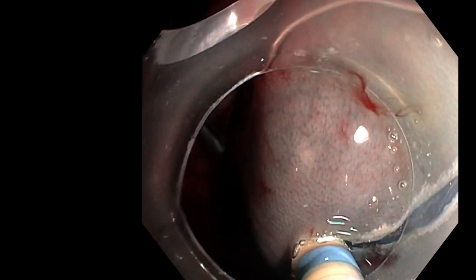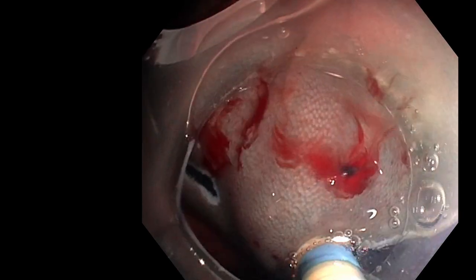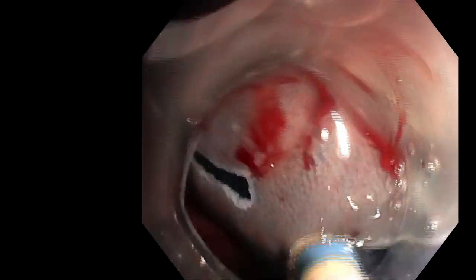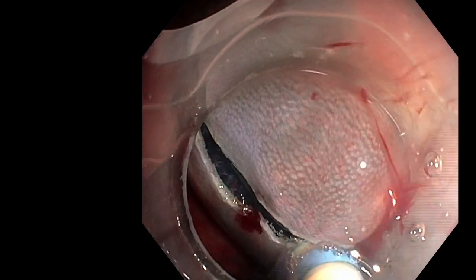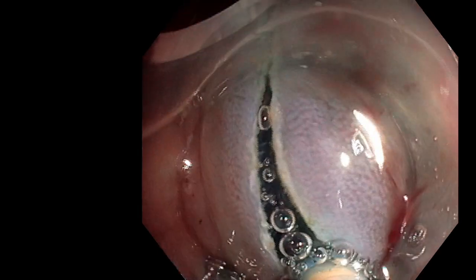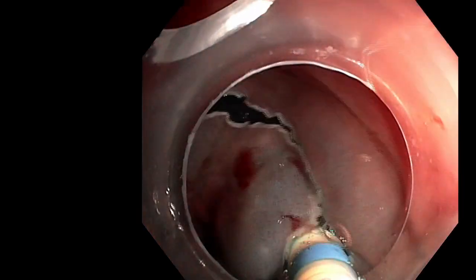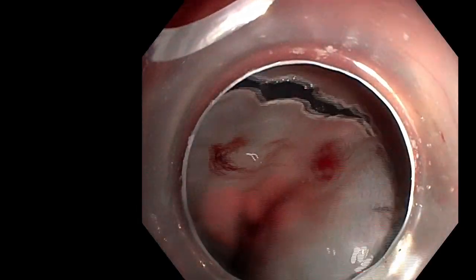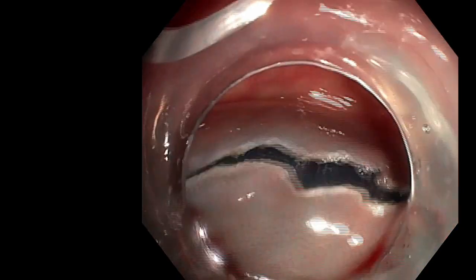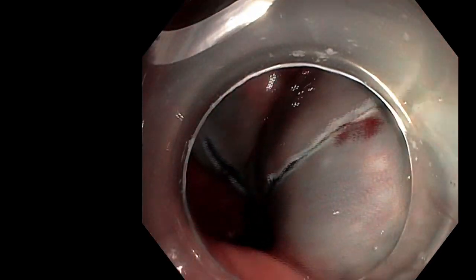Don't stop without really passing into your other incision, because if you stop just before, the elasticity of the mucosa will leave a small bridge. But if you continue and go to the opposite side, you will have a circumferential incision all around the lesion, which is quite homogeneous, I mean at the good depth everywhere. So it is an important point.